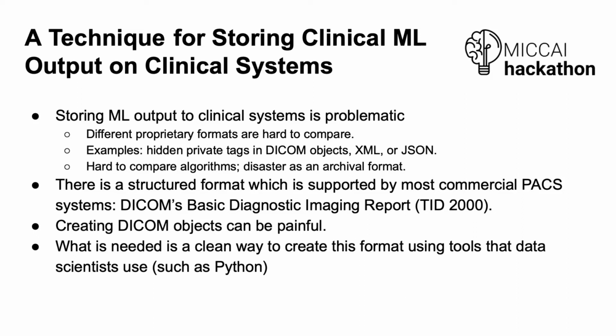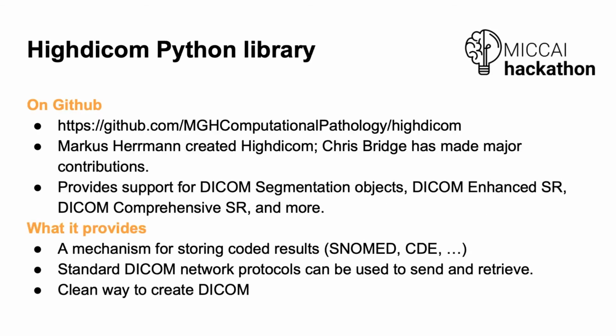And so what we needed was a clean way. If we're going to tell people you need to create this format, we wanted to make it easy for that to happen. So there's an existing Python library, which I would encourage you all to look at. There's an archive paper on it. I should have put that on here as well, called Highdicom, which supports DICOM segmentation objects, enhanced SR, comprehensive SR, but it doesn't support the basic text one, the very simple one.